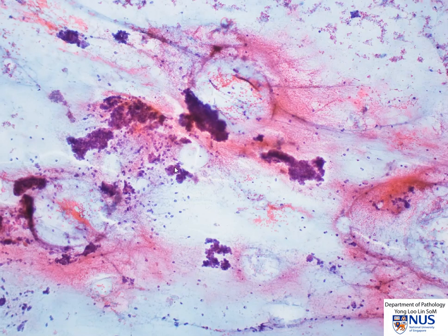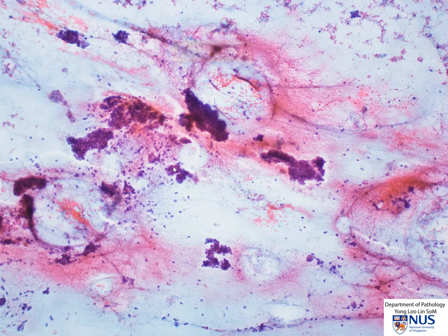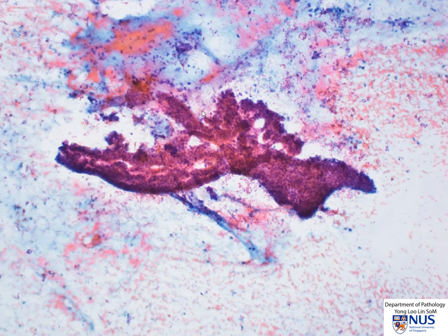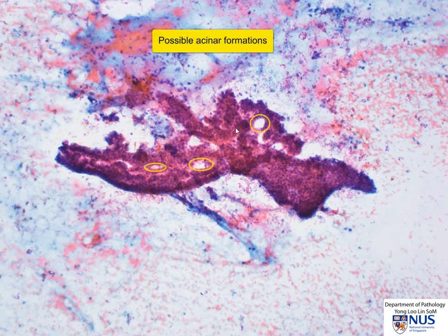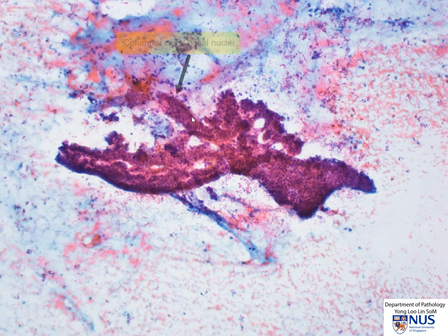Here is another area showing these little small branching tissue fragments. Some of them almost have a suggestion of a papillary or micro-papillary architecture. Here is a higher magnification view showing this rather complex-looking tissue fragment. There is a hint of some acinar formations or gland openings in some areas, and in other areas we get the idea that there may be a row of columnar cells with nuclear palisading at the edges.